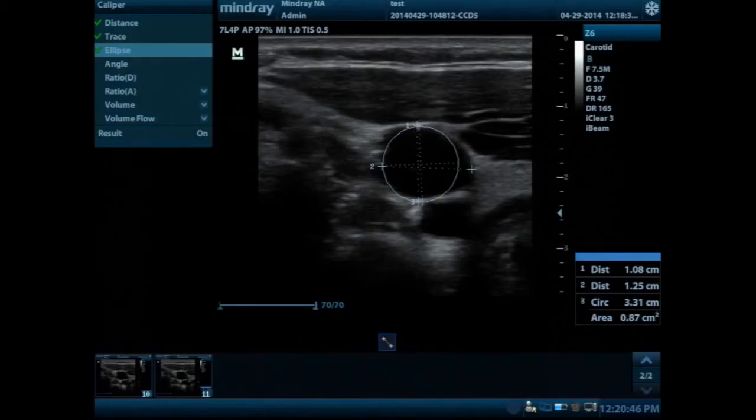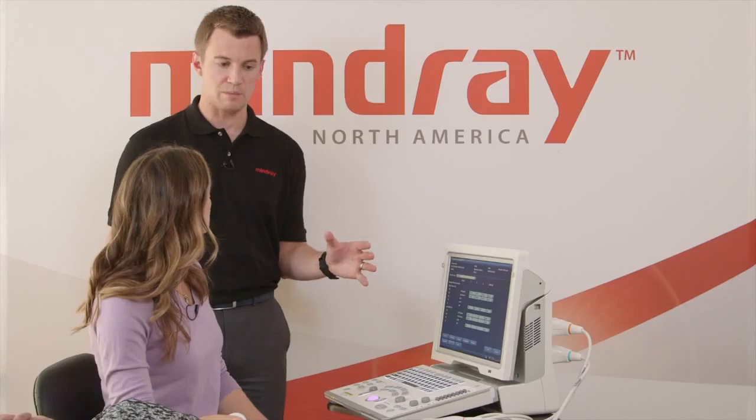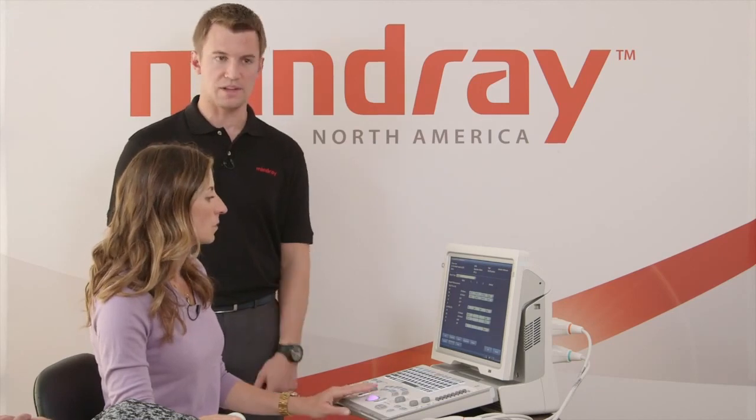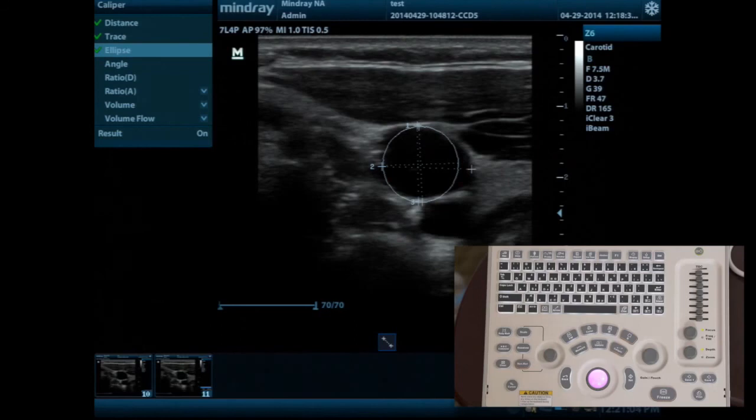This is something that we'll talk about again in our report, but know that you have the ability to go in here and delete them. So let's say you've taken 3 on each segment, and you know that your last one isn't one that you really want to keep. You can click on those and just delete them. It's straightforward. We'll do that under the report chapter.